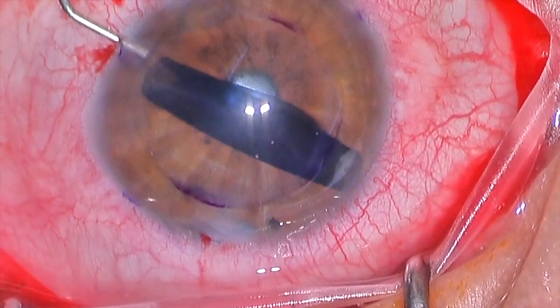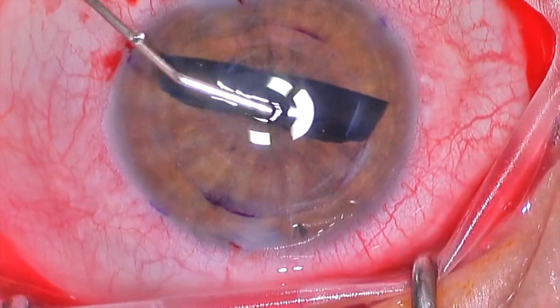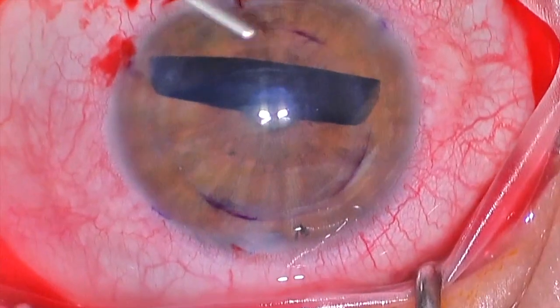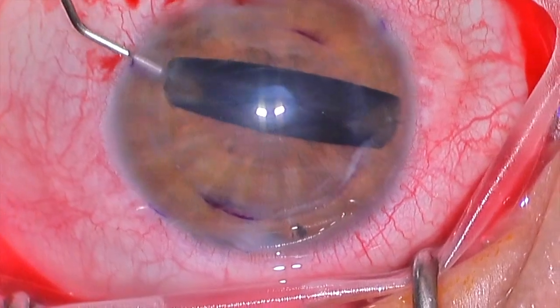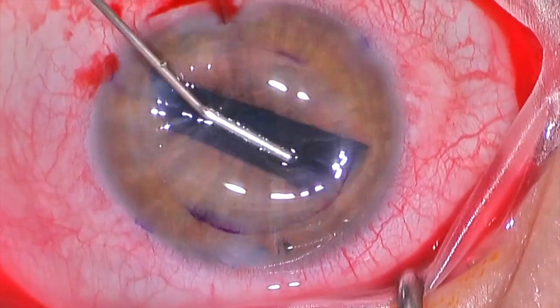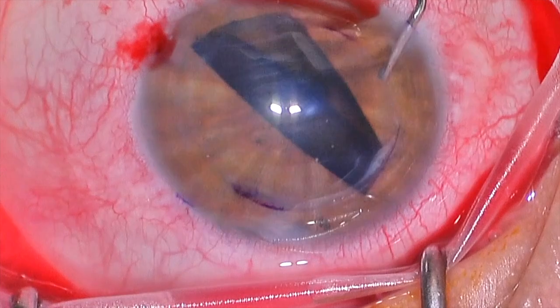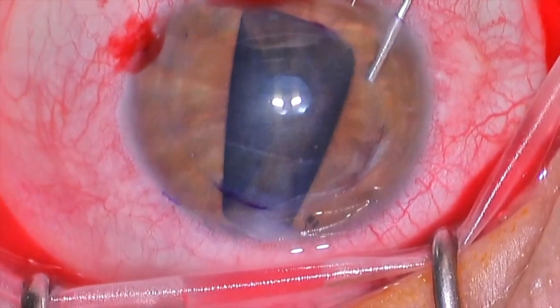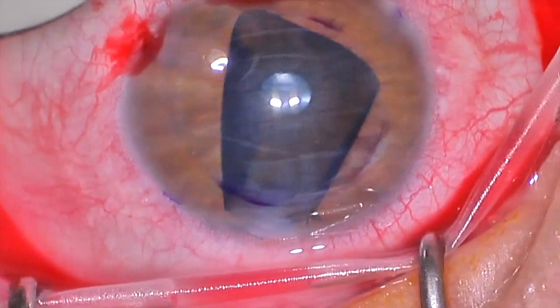I tend to prep my own tissue and I do not mark the tissue in any way so that the greatest number of endothelial cells are viable. You can get tissue that is pre-marked, which makes it much easier to tell which way is right side up versus upside down. The downside is that marked tissue tends to be manipulated more, and in my opinion the cells are potentially more damaged and less healthy, meaning the patient has a graft that is not as healthy as we would like.